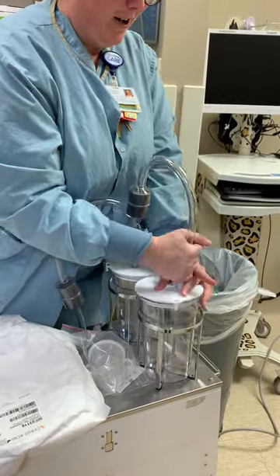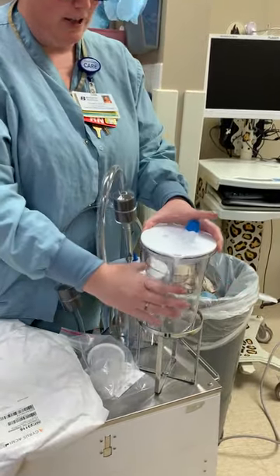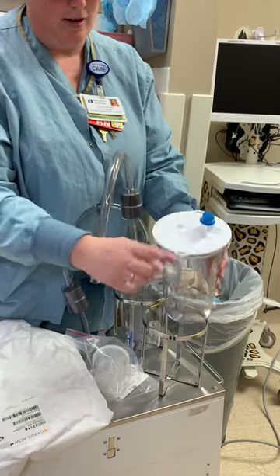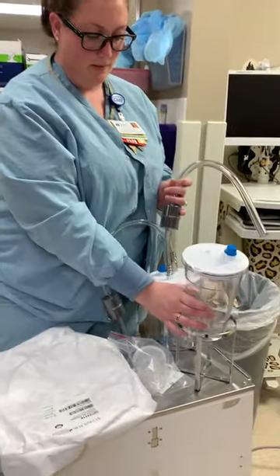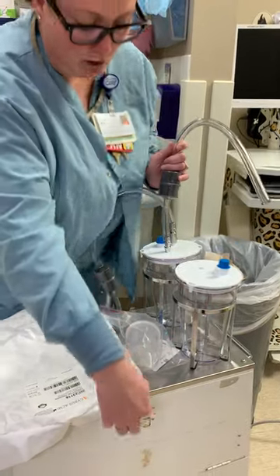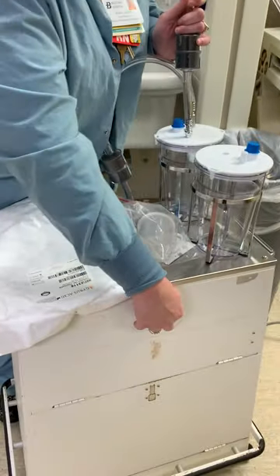Then you will unhook this — and it is hard to unhook. You can put a blue cap on that also to dispose of your container. There are more supplies to replace it in this cabinet.